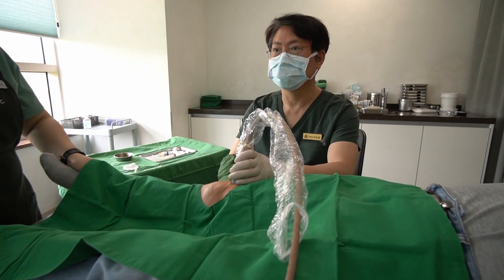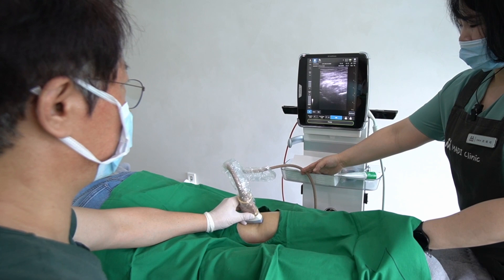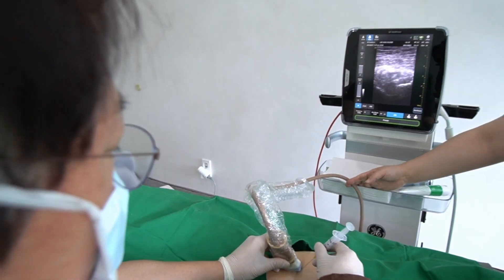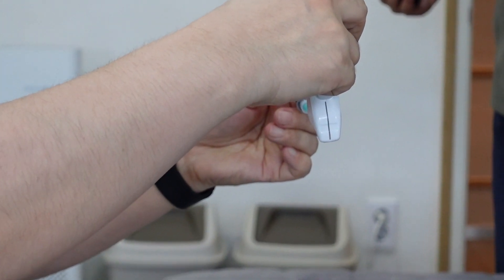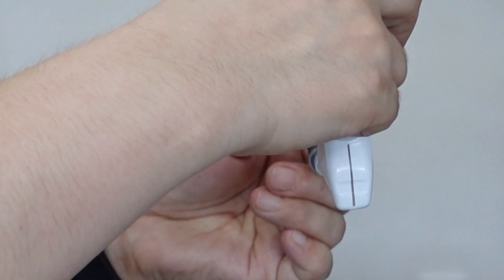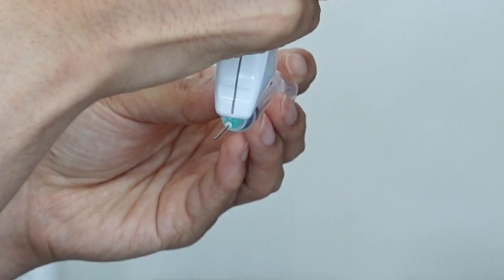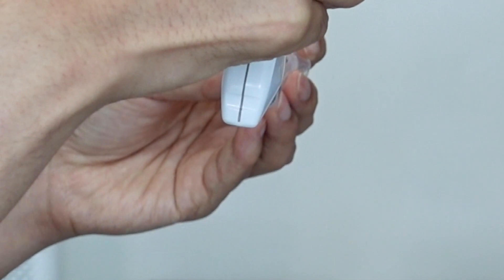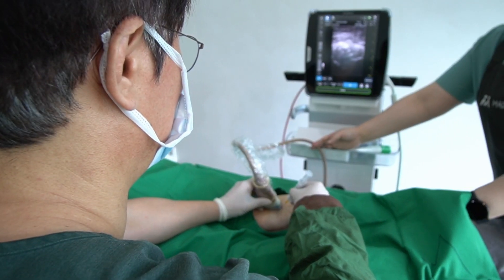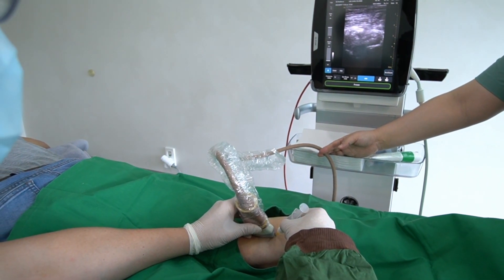Preferences can differ among individuals, influenced by their comfort level and personal technique. One crucial aspect to remember is the tendency for people to deviate medially or laterally when moving the needle from an inferior to a superior direction. Practitioners may unconsciously lean towards this deviation when guiding a needle under ultrasound. Therefore, it's essential to remain aware of your tendencies in needle movement to ensure accurate placement. I recommend determining the most suitable approach for each procedure, and while you should aim for the best method, strive always to find the most effective technique. Thank you for your time and attention — I look forward to seeing you in the upcoming videos.